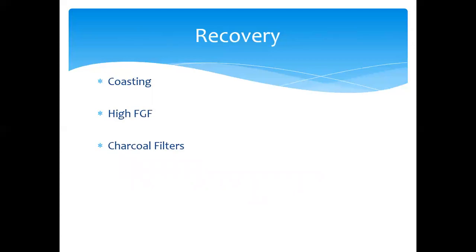In our maintenance phase, just to recapitulate, we have to slightly increase the concentration of oxygen. We have to slightly increase the concentration of volatile anesthetics because of dilution and because of uptake. And again, while low flow anesthesia might be technically and theoretically very complicated, if we have our gas analyzers, it makes life very easy. We can see in real time what is happening, and then we can play with our dials and controls to control whatever is being delivered to the patient.